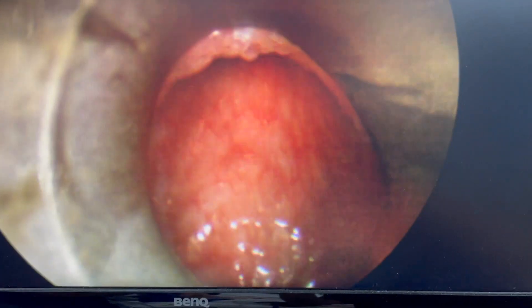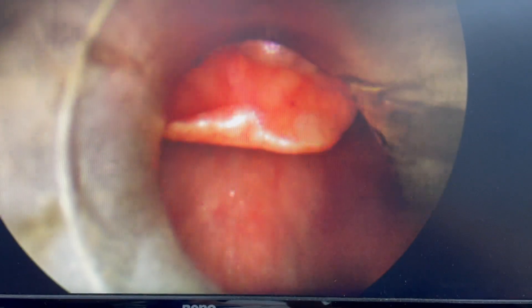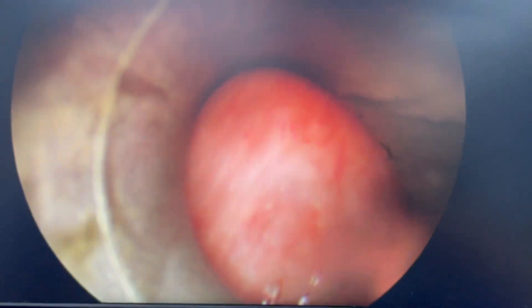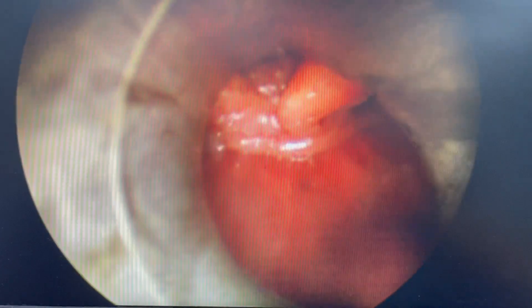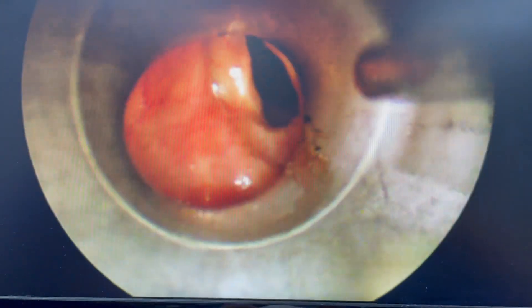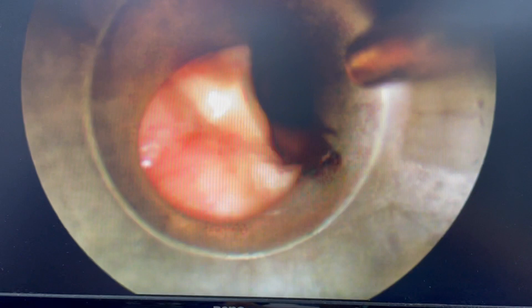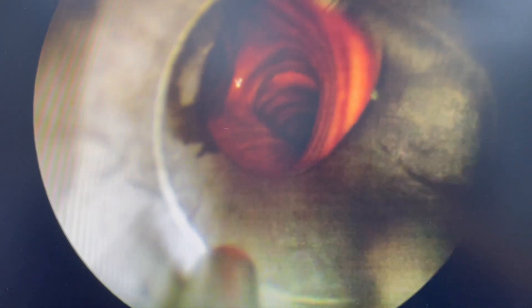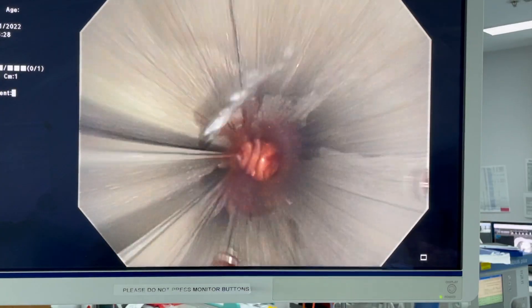Here's the rigid bronchoscope being intubated. You can see the epiglottis there — I'll lift up the epiglottis with the bevel of the rigid scope to expose the vocal cords, and once I can see the vocal cords I rotate the rigid scope 90 degrees to get through the cords into the trachea. Now I can rotate again 90 degrees so the bevel is posterior, and I can advance down the trachea and see the main carina there.